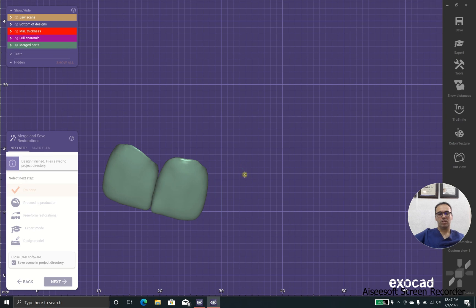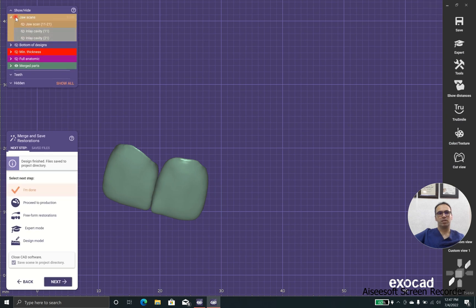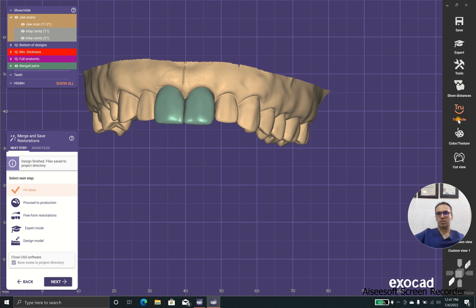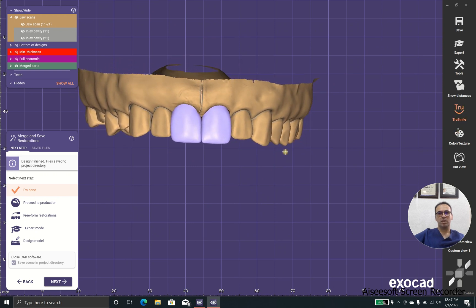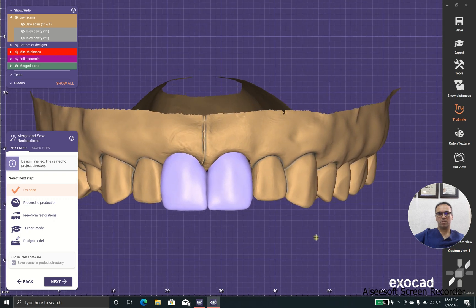Okay, we have two beautiful laminates — two healthy, beautiful laminates. And as you can see, it shows in blue, which means that it will be milled from IPS Empress.